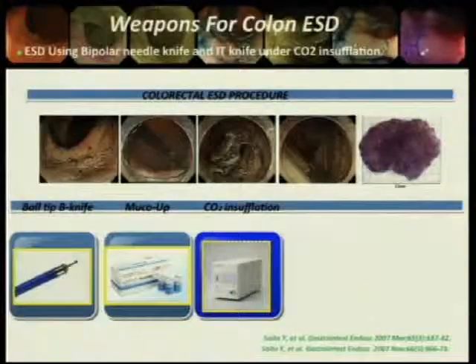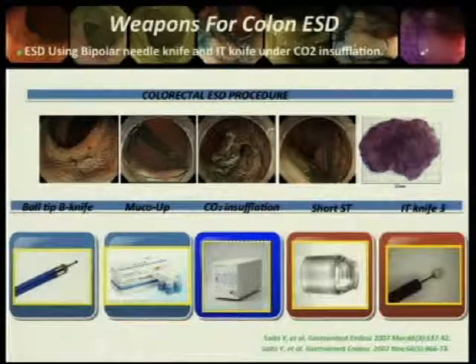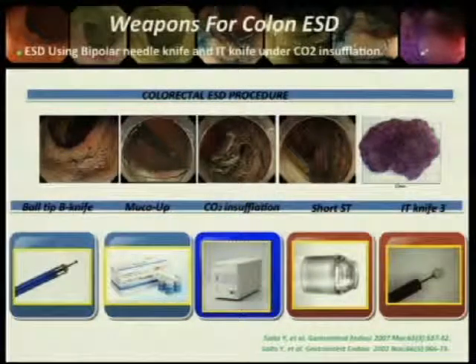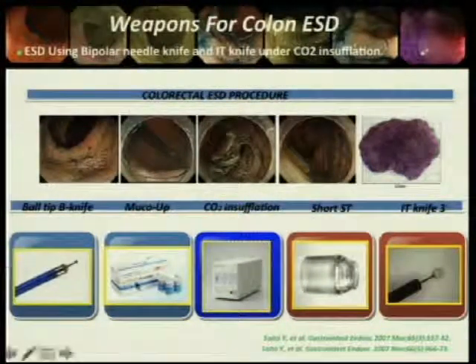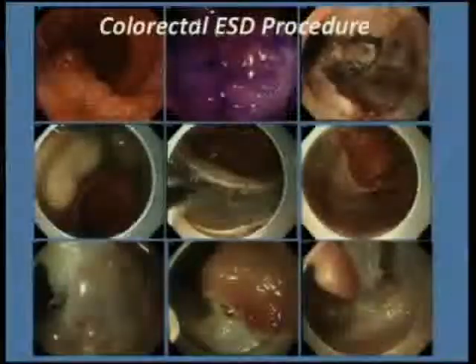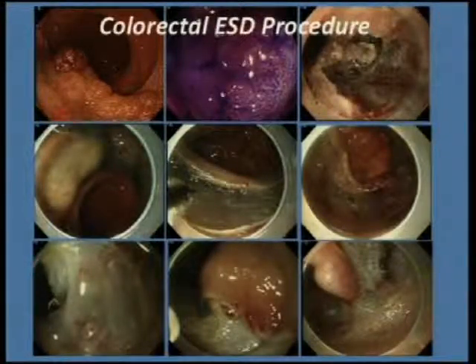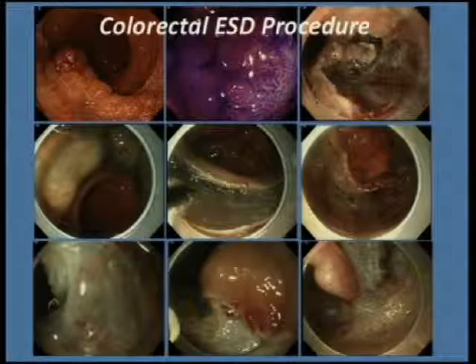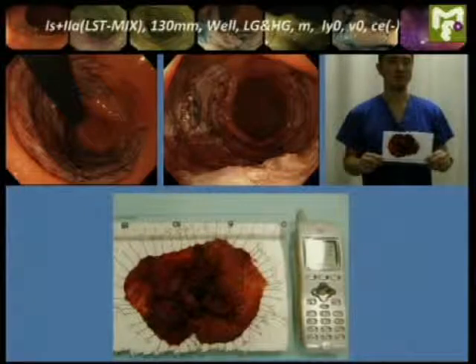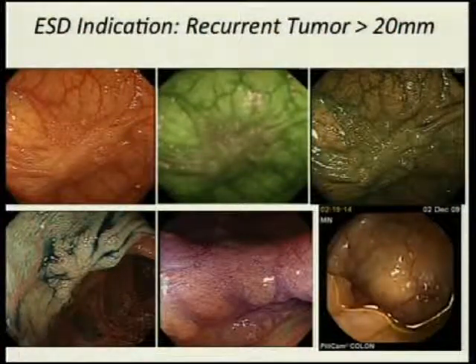I prepared a slide of the video, but I will skip it because of the time limitation. We need various devices for a safer and more effective ESD technique. We can treat this kind of large lesion effectively and safely. Of course, we need the learning curve for ESD, similar to TEM.